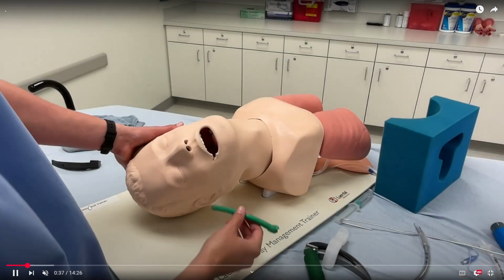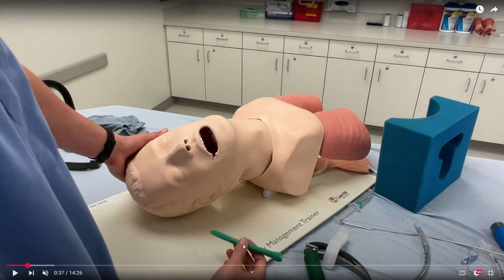Now for the nasal airway insertion. Now one thing to keep in mind is this is plastic, and this entire mannequin is plastic. Because it's soft plastic against soft plastic, there's going to be a lot of resistance. There's going to be a lot of resistance on nearly all of these procedures. So if I'm looking like I'm struggling to insert something or pushing really hard or having to do something over multiple attempts, it is because it is plastic on plastic. In a real human being, there's going to be secretions and saliva that will help lubricate this process.